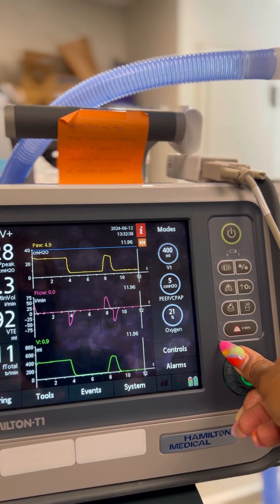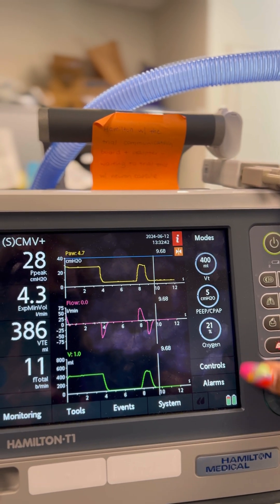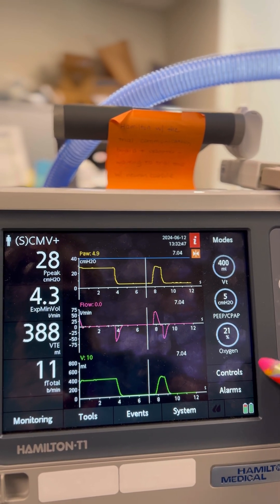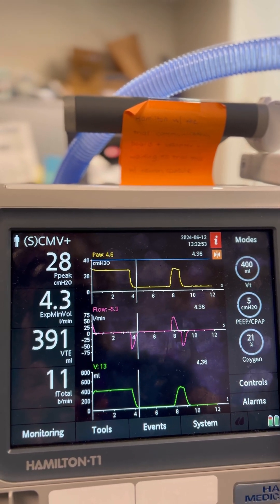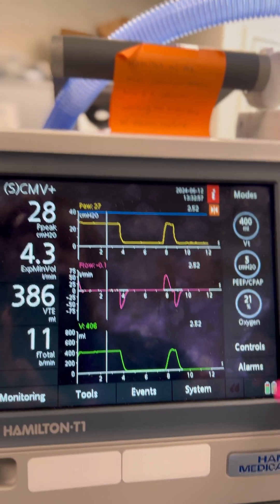We're going to use this knob here to scroll all the way to where that waveform is where we did the inspiratory hold. As we're scrolling, you can see that at each of these points we're able to get the exact airway pressure, flow, and tidal volume. We're going to scroll to where we did the plateau or inspiratory hold maneuver.